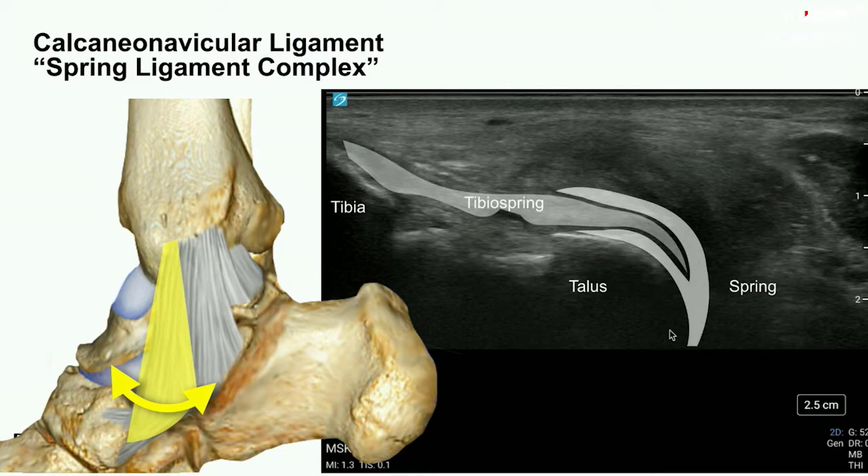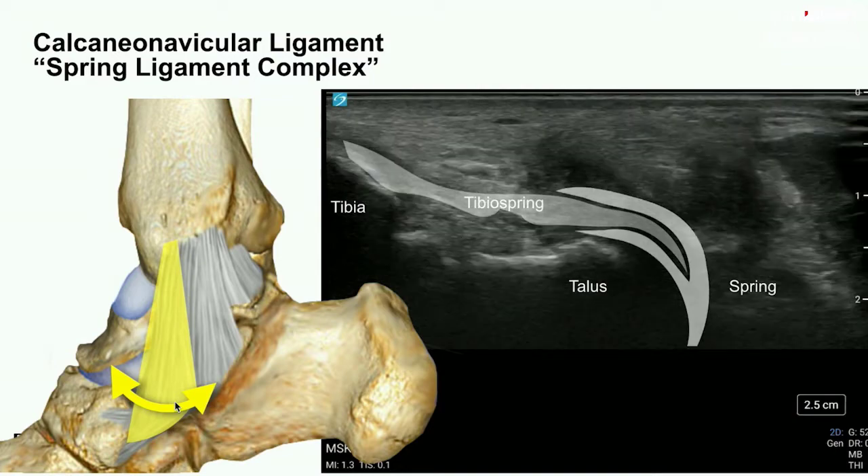Here we have a cross section of the spring ligament, with the interdigitated tibial spring ligament. Here's the tibia and neck of the talus. We're seeing a bit of the tibionavicular ligament superficially and a bit of the anterior deep tibiotalar ligament — those sandwich the tibial spring. We're going to windshield-wiper the distal aspect of the probe: plant the tibia side, swing it across until we see the navicular superficially, then swing back to the calcaneus deep, and split the difference for a dynamic maneuver.